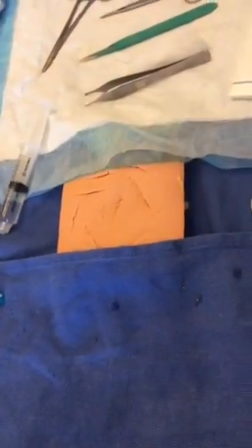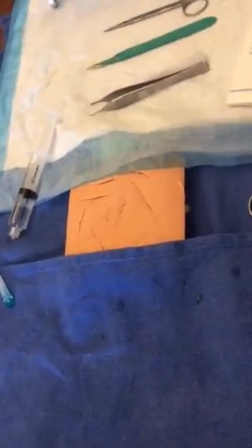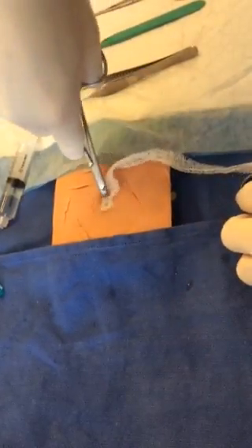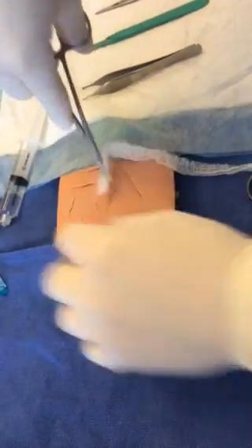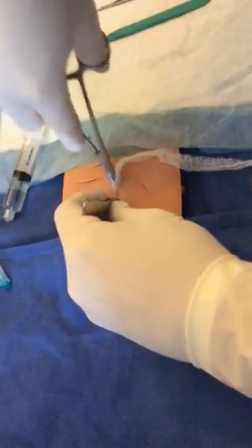All right, from there, we need to pack this wound. So we'll take our materials here, and we will begin to pack the wound. All right, just as so, putting the packing in with our curved Kellys. So right here to the side, put the packing in.